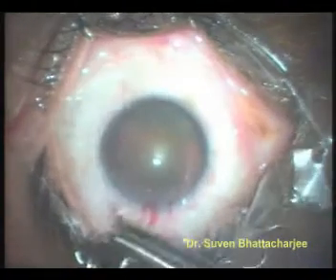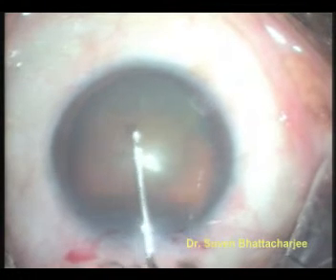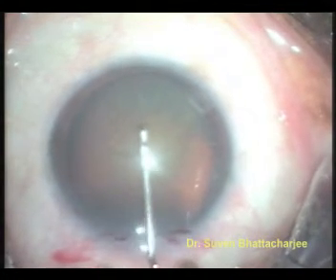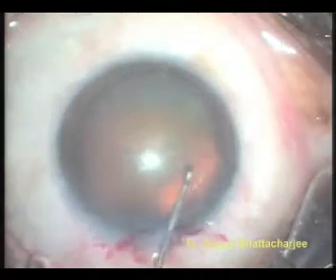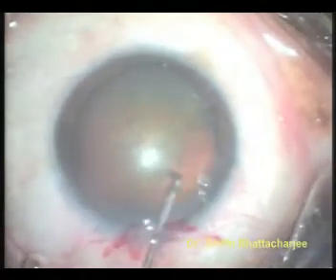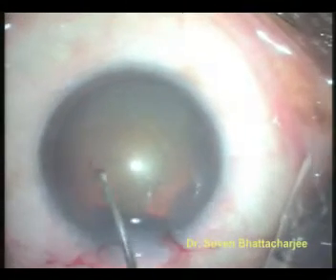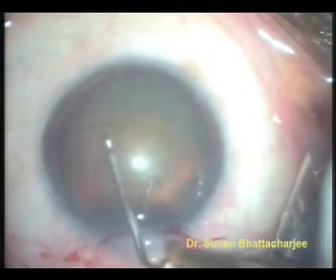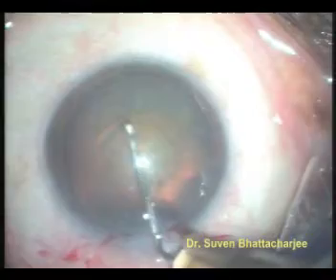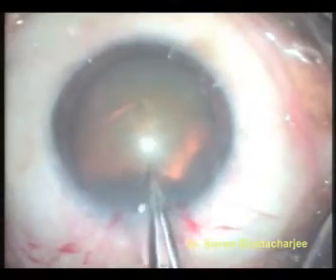A 26 gauge needle is bent at its tip and along its body and used to make a circular opening in the anterior capsule, which is called continuous curvilinear capsulorhexis. This is like making a circular opening in the transparent peel of a mango. The piece of the anterior capsule is removed with the forceps.